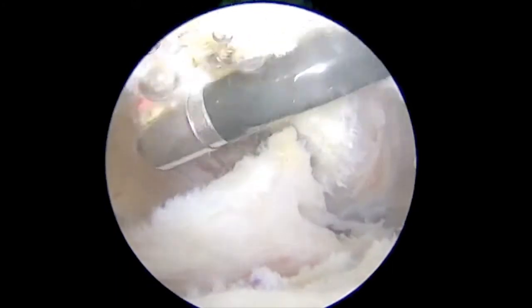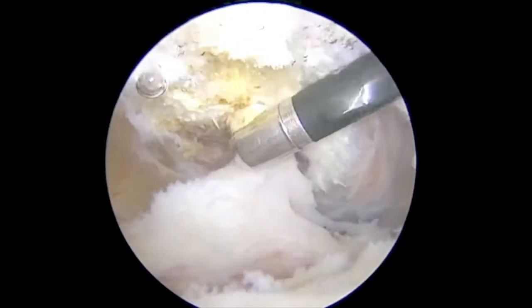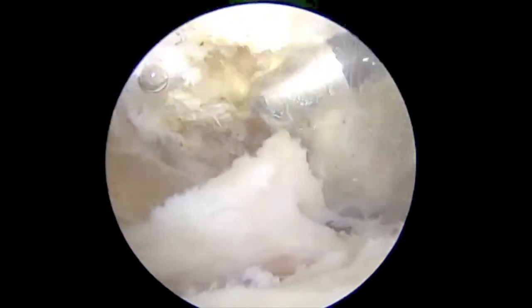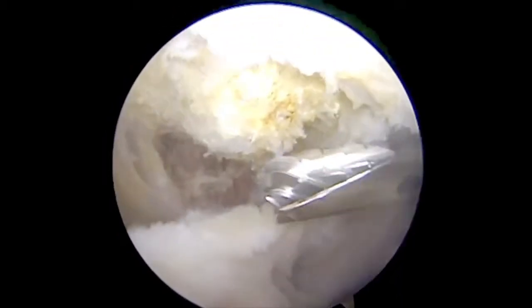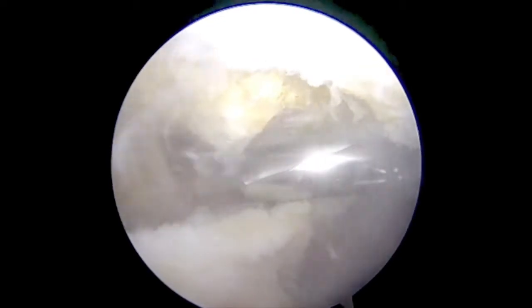A subcoracoid decompression with coracoplasty is performed using radiofrequency to clear soft tissue off of the bone. Then an arthroscopic oval burr is used to remove osteophytes from the coracoid, thus preventing future subcoracoid impingement on the subscapularis tendon.